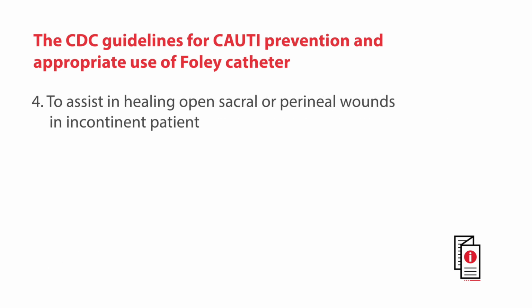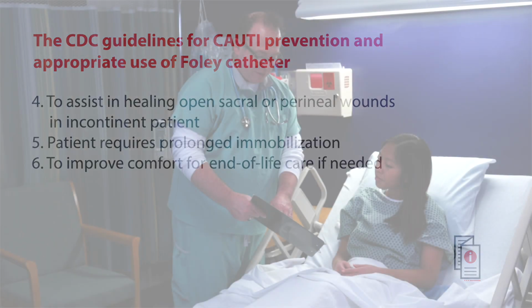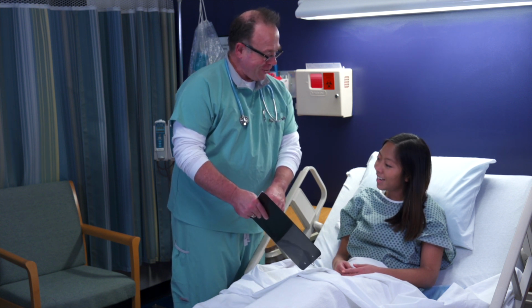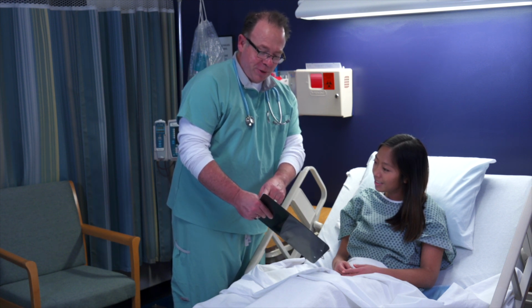Other indications include incontinent patients with open sacral or perineal wounds, patients subject to prolonged immobilization, and lastly as a comfort measure when needed in end-of-life care. We also want to check to see if the patient has any allergies such as iodine or latex. Finally, review the chart for pathological factors that may impede the passage of a catheter. It is important to assess your patient.